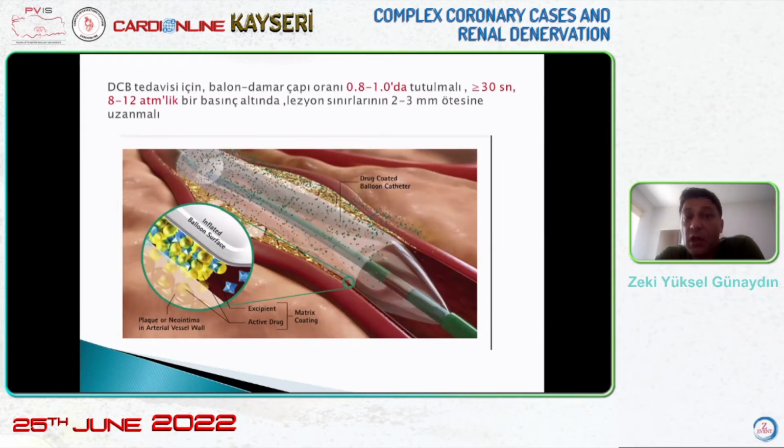The inflation is required to be a minimum of 30 seconds or more to ensure full adhesion, at a pressure of 8 to 12 atm. And the auxiliary material is important in order to increase penetration into the tissue.